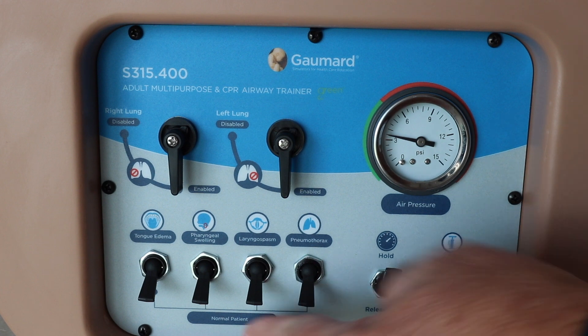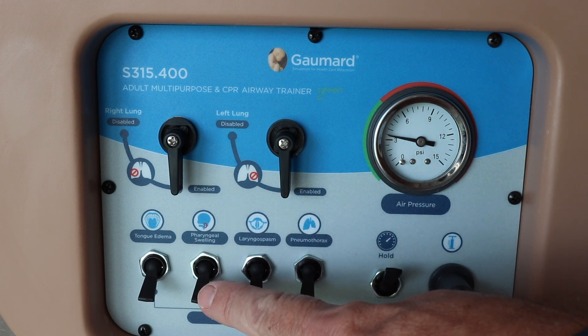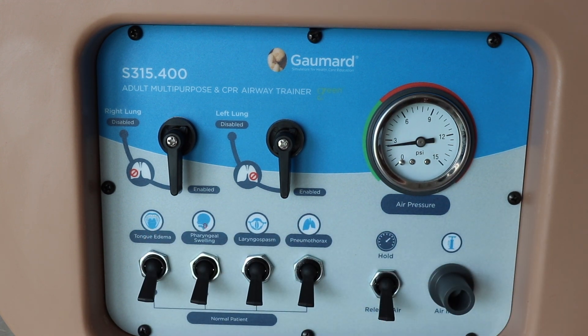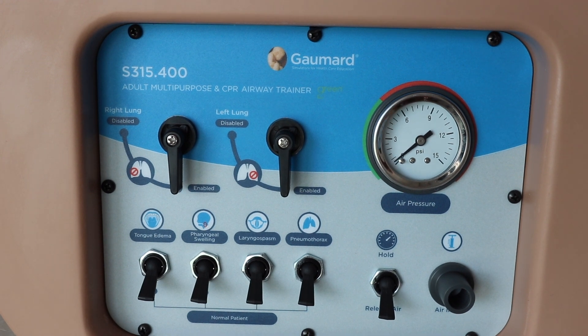This switch here that I'm flipping up and down mimics laryngospasm. This other switch mimics pharyngeal swelling, and your last one simulates tongue edema. So if you've got someone with an allergic reaction or laryngospasm, you activate those as well. On the bottom right beside hold, if you've got a pneumothorax scenario, you want to flip that switch to charge that part of the system. Just remember — when you disable a lung, that side just won't inflate. If you want your student to do an actual decompression, you'll have to flip the pneumothorax button on the bottom in addition to disabling that lung.